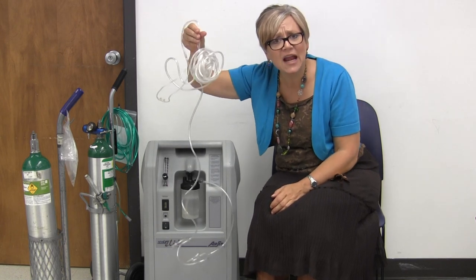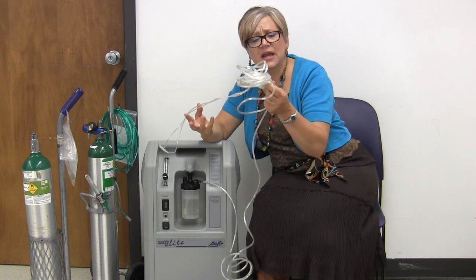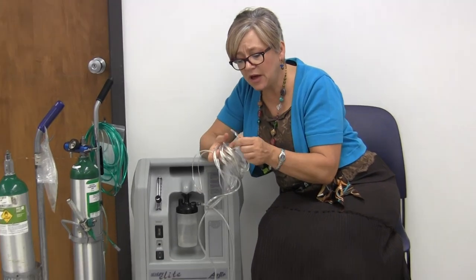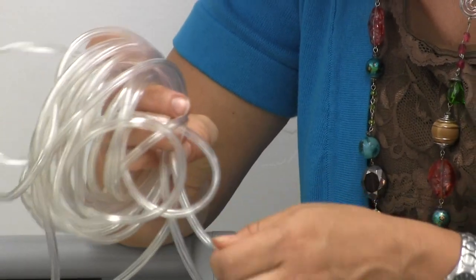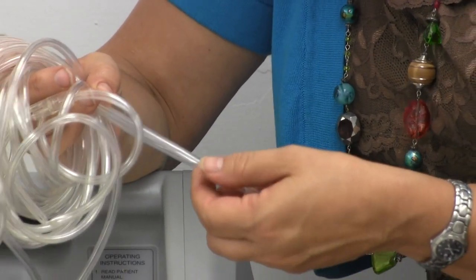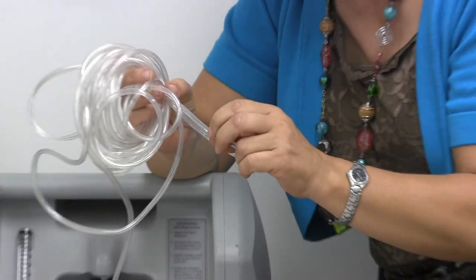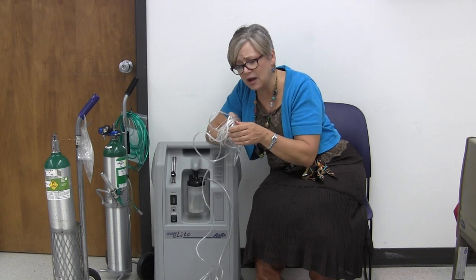Tubing! It can get wadded up in a ball, it gets kinks in it — look at that kink right there. That's no good. Sometimes you just have to work it and pinch it back out to get the air flowing through there. Sometimes you're just going to have to get a new set of tubing, because once that area is kinked really well, it'll just kink again on you. You've got to look — maybe they really aren't getting oxygen.